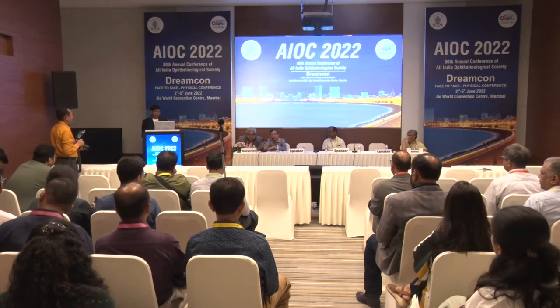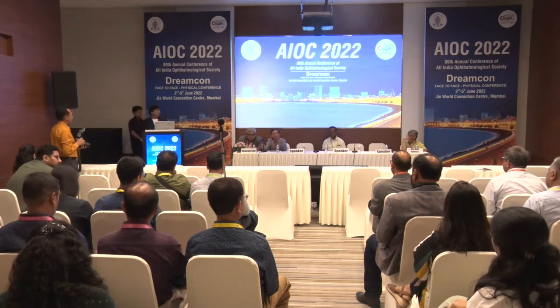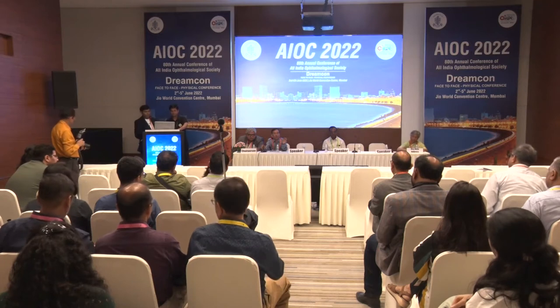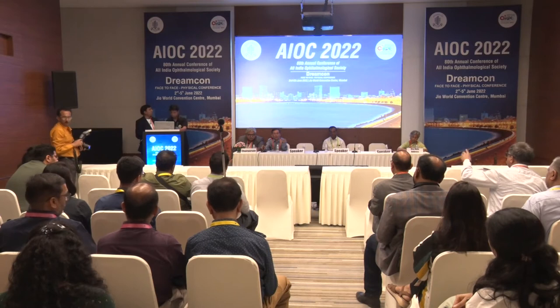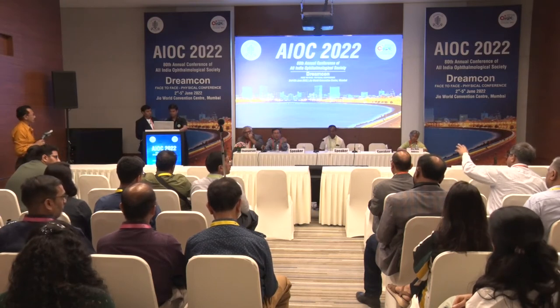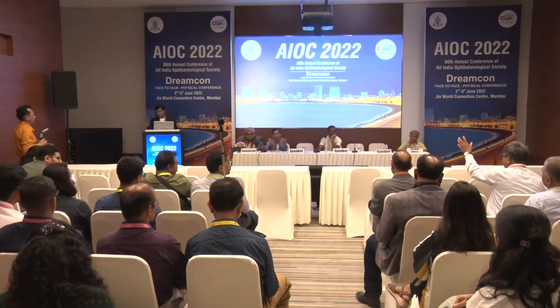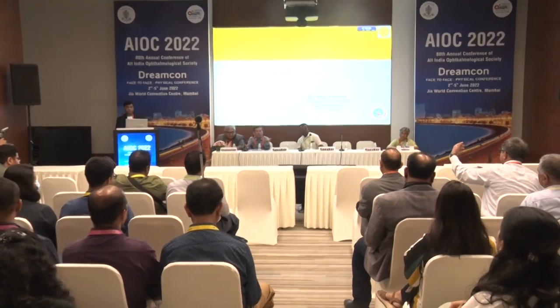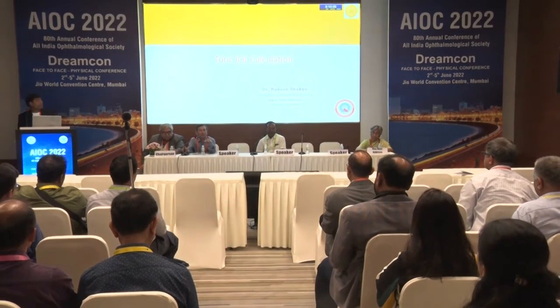IOL Master 700 will not take it because it itself is measuring the posterior corneal curvature, and then they are calculating. So it is incorporating the actual posterior corneal curvature. So you get the exact data, not double. What your question was... So you are using IOL Master, you get the biometry and the posterior corneal K reading, and Barrett's. So whether it will get incorporated twice or not? No. Because it itself is measuring. So they are taking the actual value of the posterior corneal curvature.